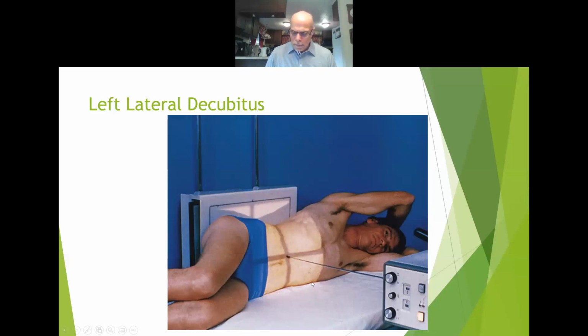We call it by the side they're lying on. Okay. If the patient is too ill to stand, we want to do the decubitus in place of the upright, the lateral recumbent position lying on a radiolucent pad. This does count. The mattress does count. You want to see the little bit of light right here on that bed. That's telling you that you'll be able to see any type of fluid levels down here that accumulate.